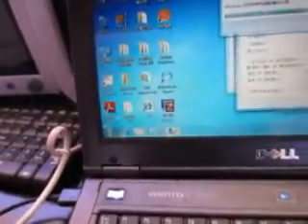We might have to close the browser and open it again to go into the setup pages.